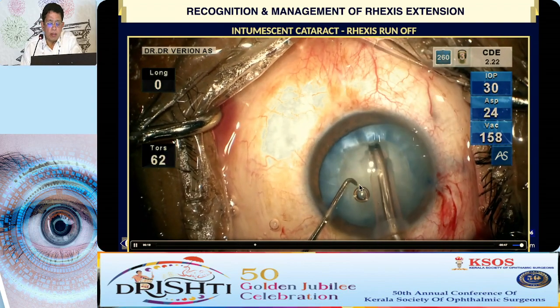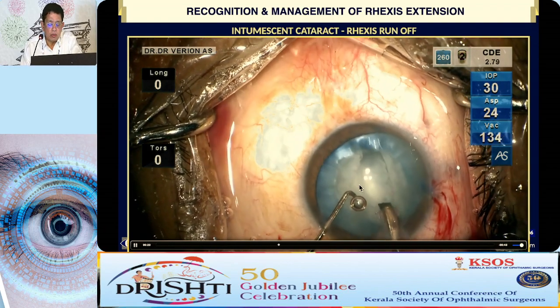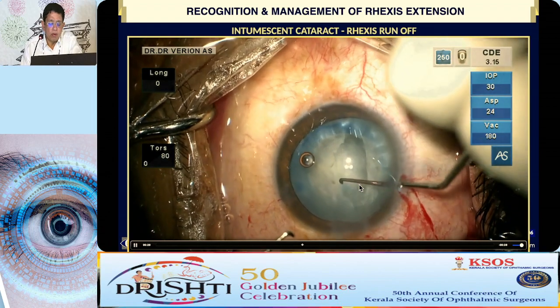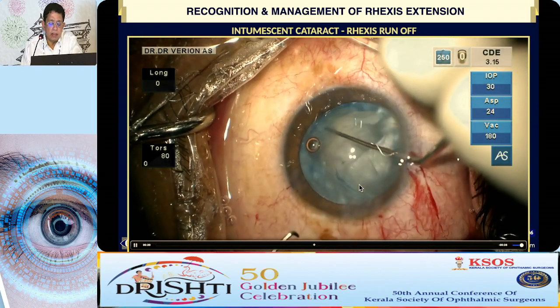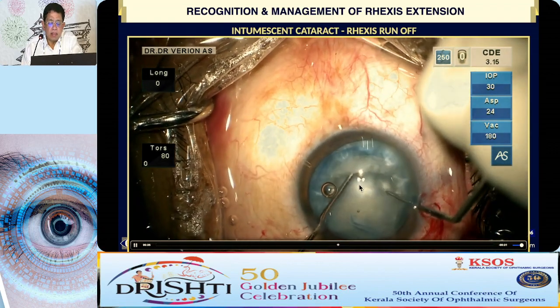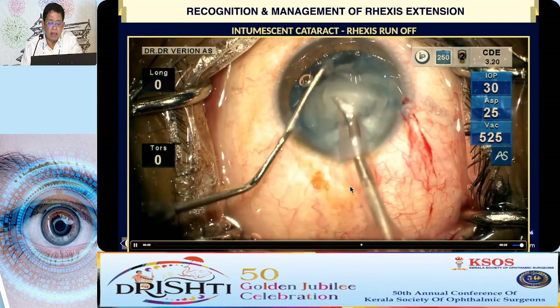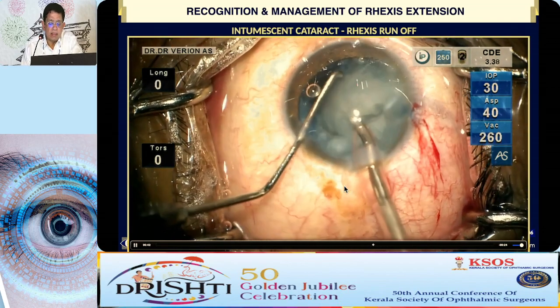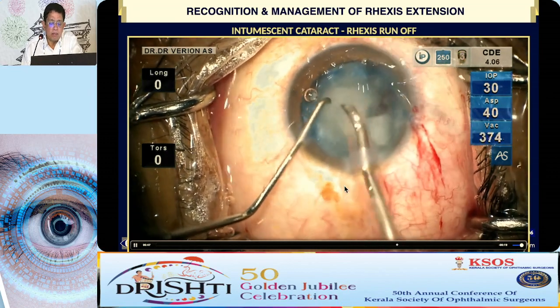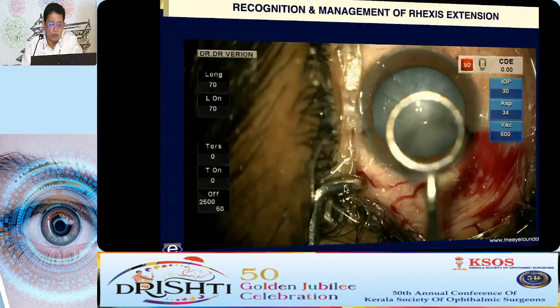So essentially what I do is go ahead and create a central crater. Again, the parameters I use are significantly less than what I would normally use, but then hardly any phaco power is needed. Subsequently, I rotate the nucleus by 90 degrees, and the separation I do with two Sinskey hooks, not creating any stress on the capsular bag in these areas. And then subsequently removing the nucleus. Again, it is in the anterior chamber phacoemulsification that we essentially do, after which the intraocular lens is introduced.